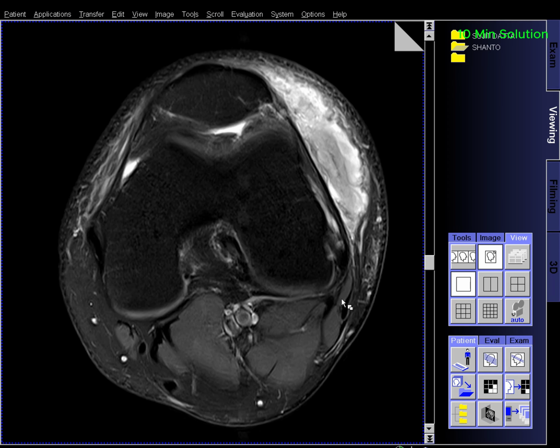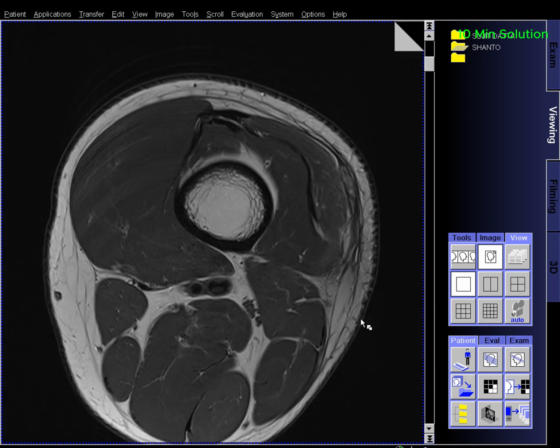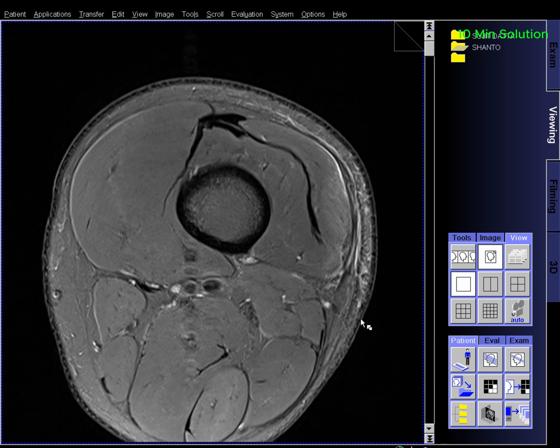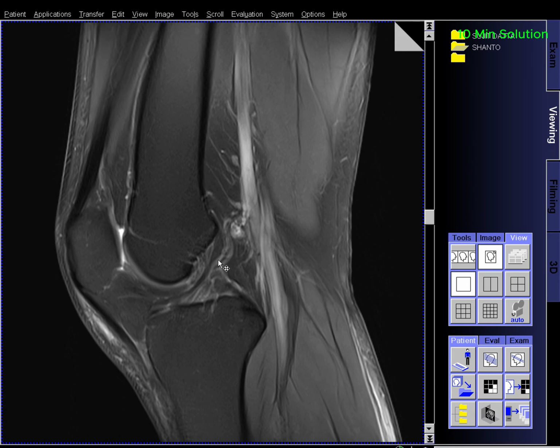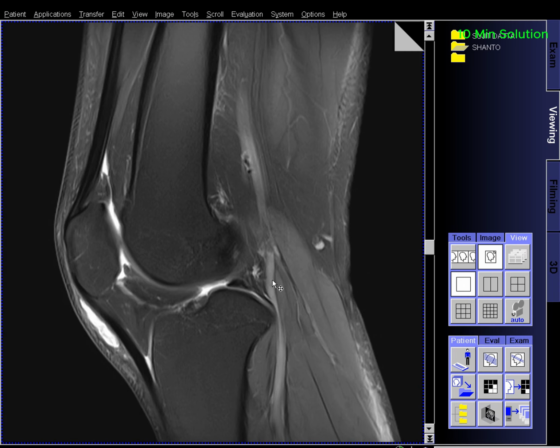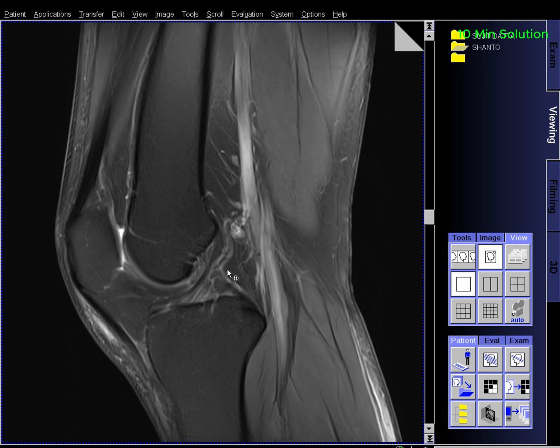Mechanical knee symptoms: catching, locking, snapping, crepitus. Vascular conditions: entrapment, aneurysm, stenosis, occlusion. Neoplasms of bone, joint, or soft tissue. Infections of bone, joint, or soft tissue. Ligament tears: cruciate, collateral, retinacular; osteochondral and articular cartilage injuries. Osteochondral fractures.